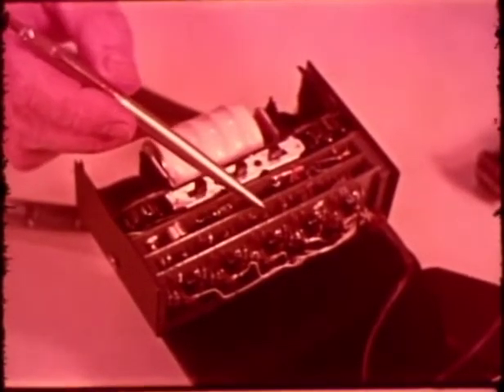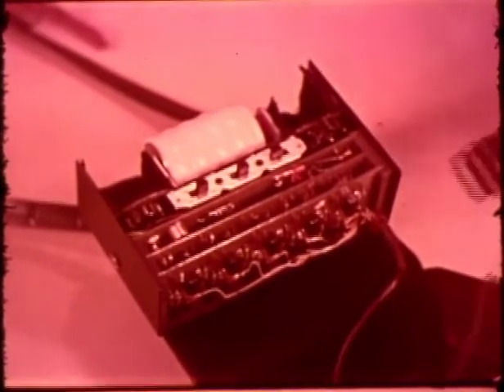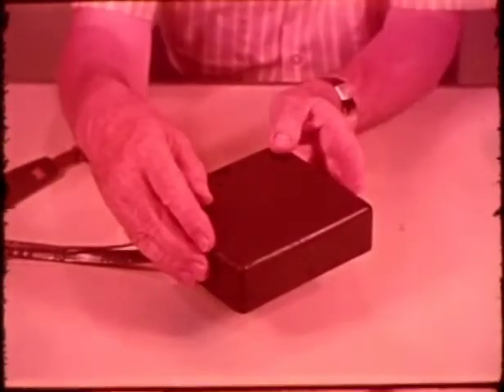The control box contains the electronic circuitry, a rechargeable battery which can operate the Stereo Toner for up to eight or nine hours between charges, and storage spaces for the two earphones and the probe. The box is about five and one-half inches wide, four and one-half inches high, and weighs 17 ounces.